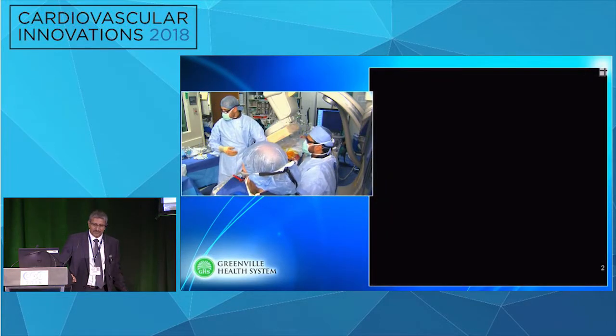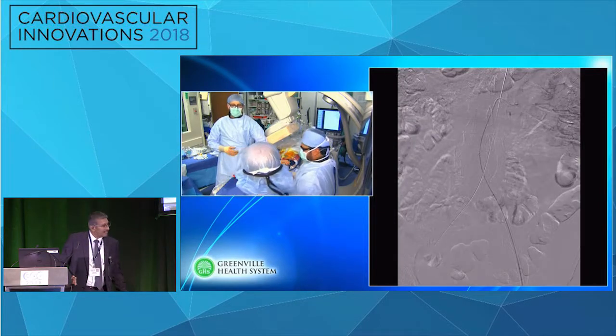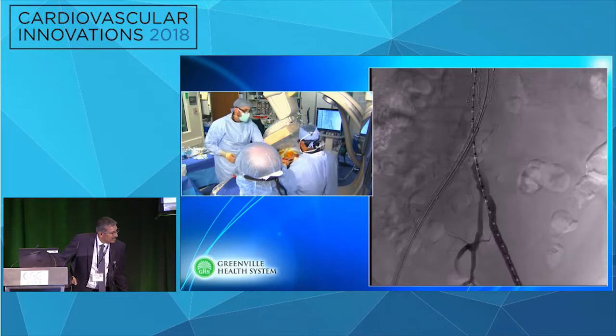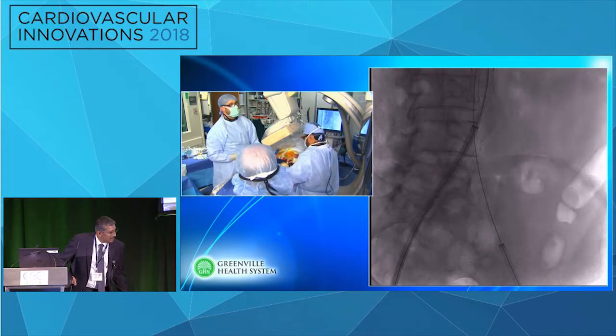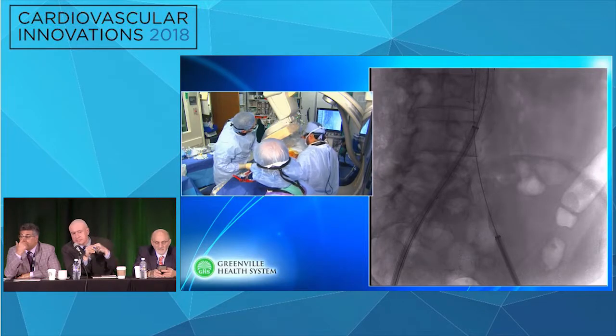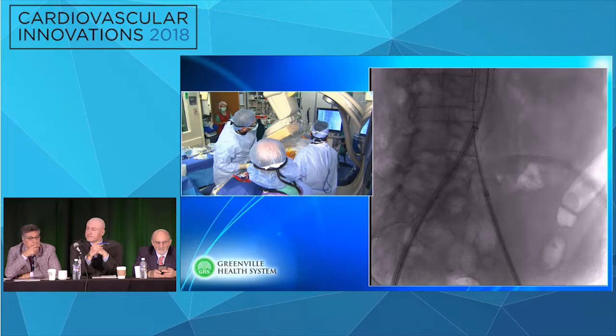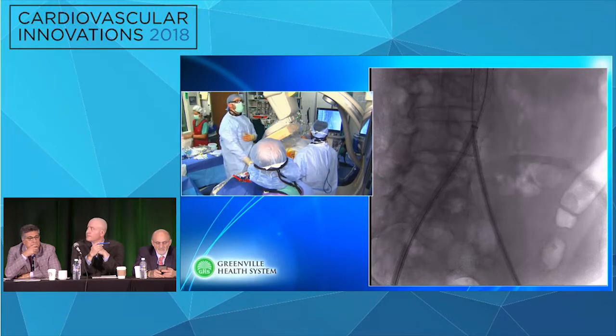One thing about a lot of these devices is that the wire doesn't take a center line measurement, as Mehdi was talking about earlier. And so sometimes you'll miss a little bit, especially when you cross, because that adds more real estate. So that's why I was asking that, because it looks perfect, but it could be slightly short.